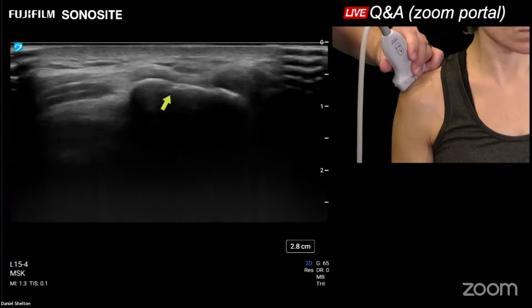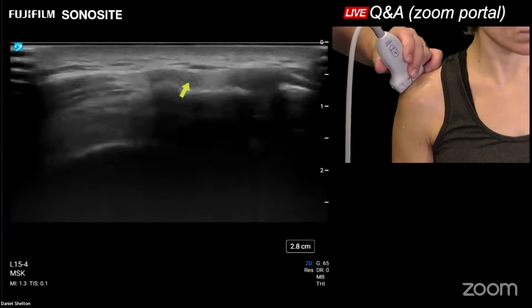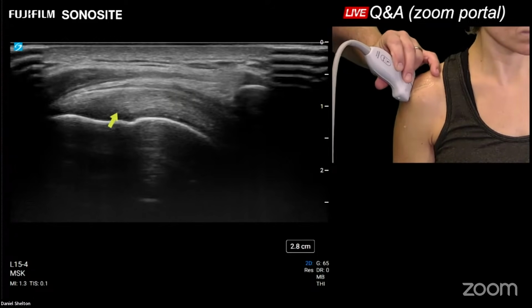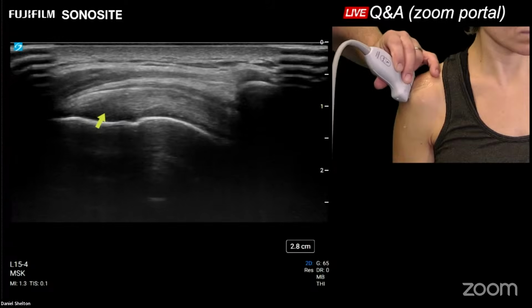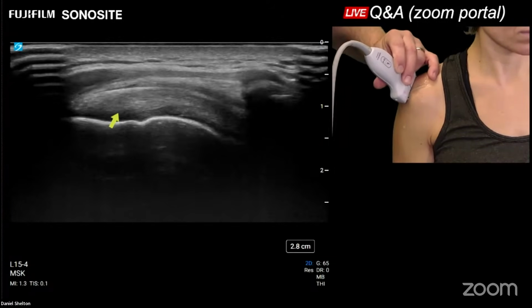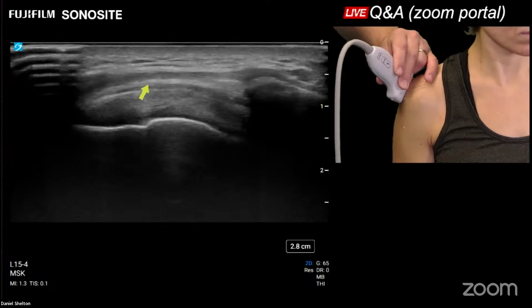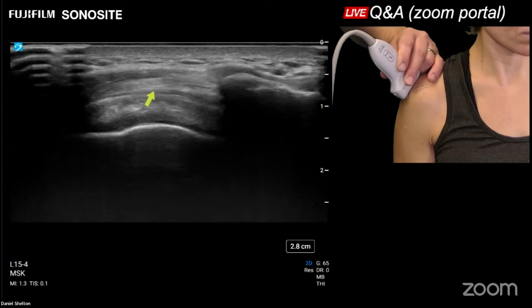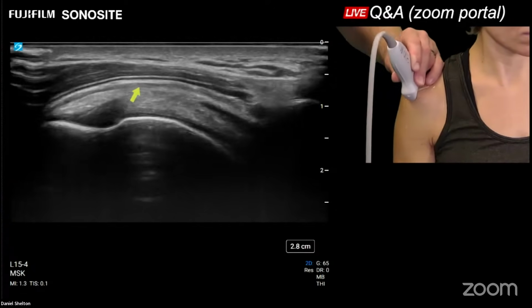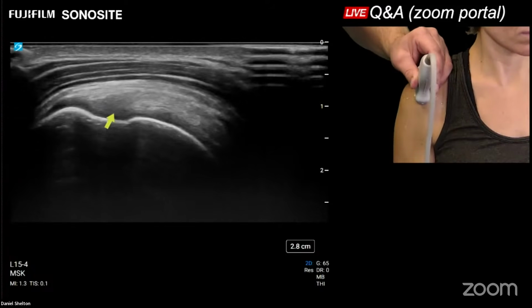So we've got the acromion process up on the upper corner here, screen right, and then you've got greater tuberosity, screen left here. That shadow of the supraspinatus right there is our anisotropy, so don't call that a tear. And then we have our subacromial space. So before we put our patient into that modified CRAS position that we went over on part 2 on the lateral shoulder, we might as well scan and evaluate what we can see without stressing the tendon.